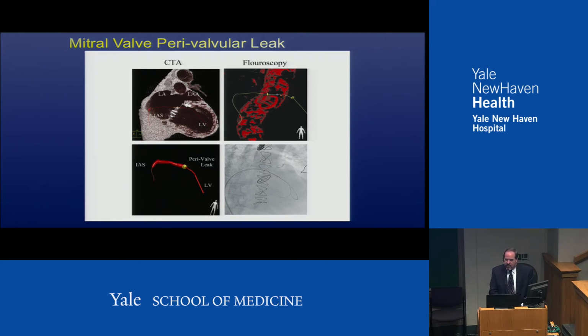So this is the CTA, shows a volumetric show on the left. You can see in this patient who had terrible aortic calcification, that's what's shown in red. You can see the mitral valve in this case. Well, we set that center line I was telling you about in the lower left corner. So you set the center line. We actually can move that into the 3D space and see how the center line is up the same view, same position. And then you can see the catheter in the lower right with the wires actually going through the hole in the same position. So again, looking on fluoro or where you want to be is critical, and we can plan that up front.